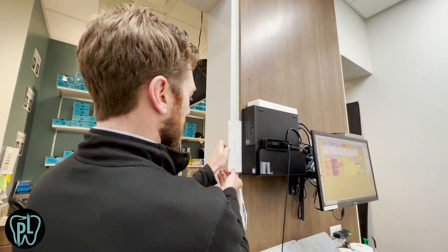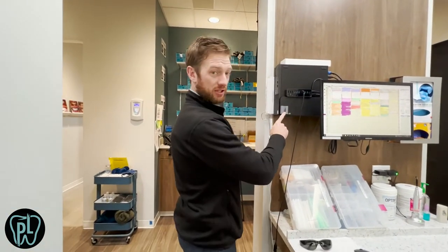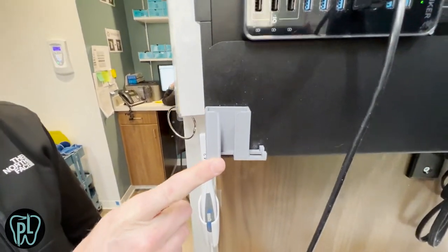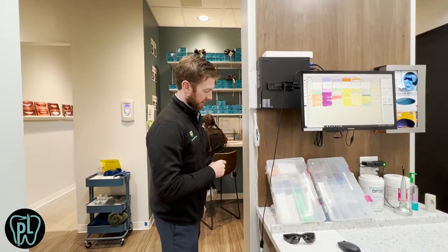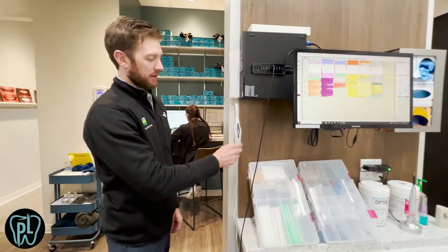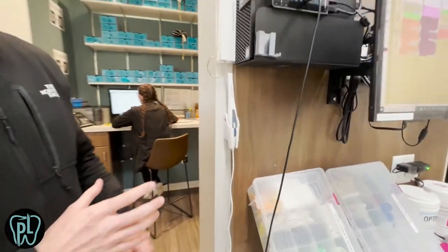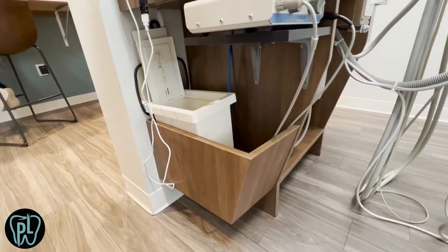In order to save our sensors, we bought these sensor hangers — you can get these on Amazon or eBay. They'll be on my supply list, and in fact everything in this room will be linked with an Amazon supply list I created to help streamline the ordering process for you and your team. I like having the intraoral cameras mounted right in the room; case acceptance goes way up. We also have a small garbage bin on this side, which works out really well.